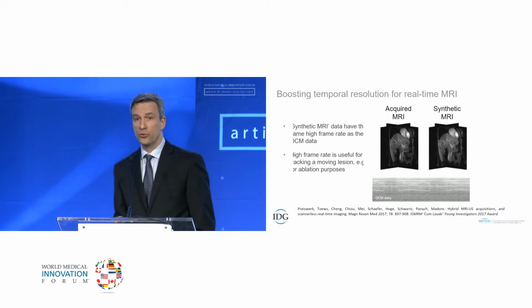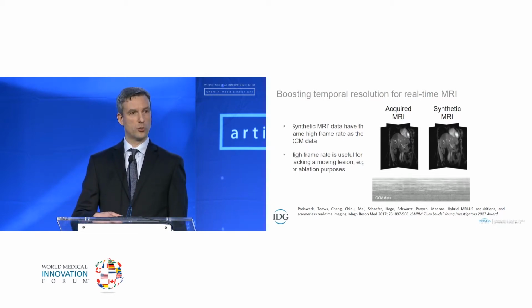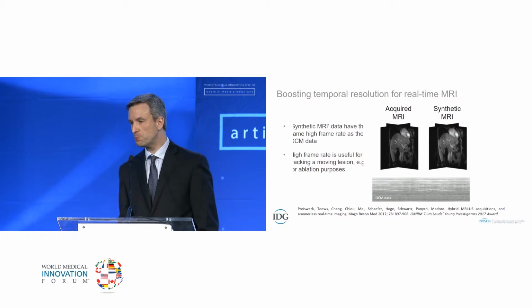Having higher temporal resolution can be useful, for example, in applications where one wants to track the anatomy as it moves, as in ablation, tumor ablation applications, for example.